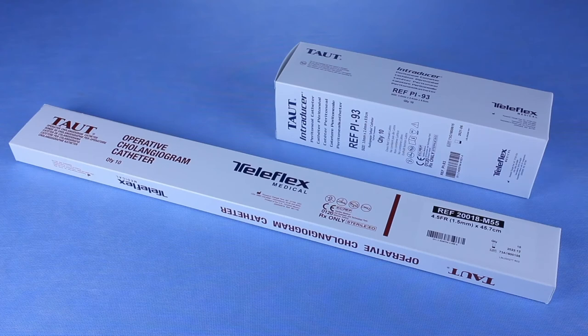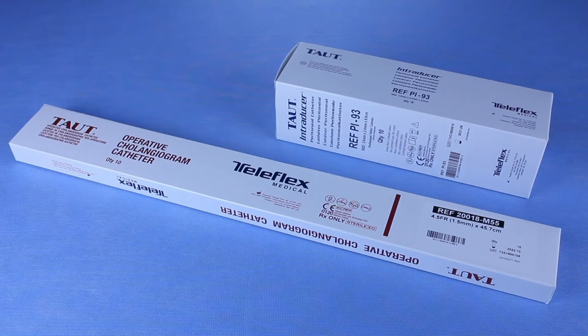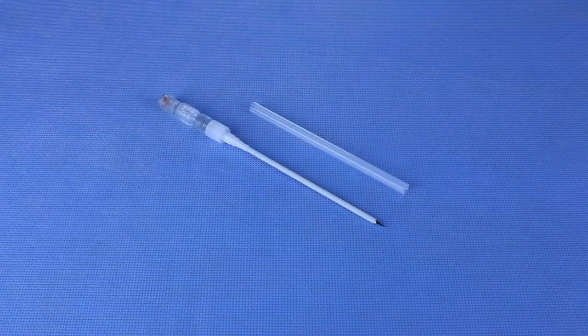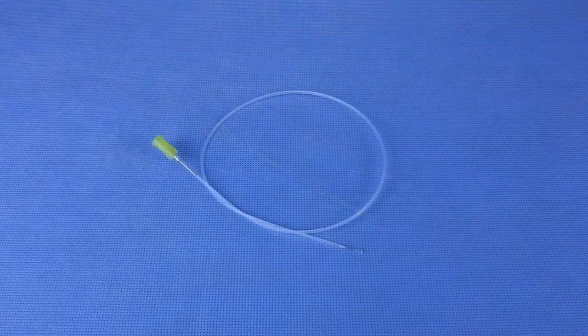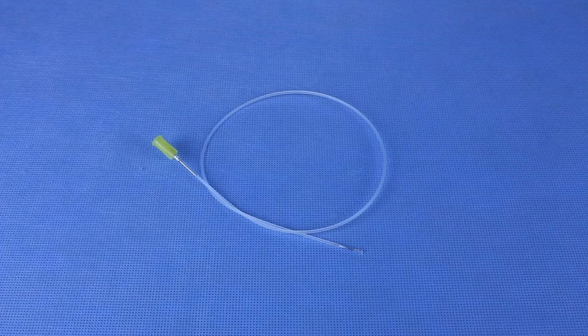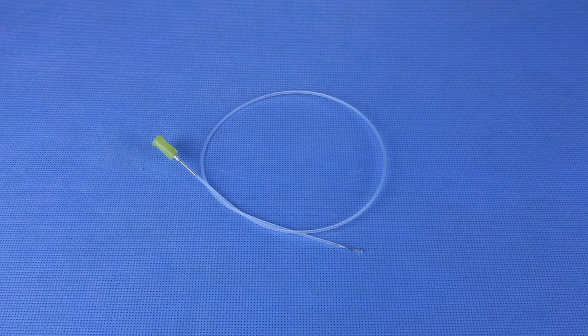Taut cholangiography catheters are used to facilitate the introduction of contrast media into the biliary ducts to obtain a cholangiogram during laparoscopic or open cholecystectomy. Taut introducer peritoneal catheters are used to provide an access port for taut catheters into the peritoneal cavity.